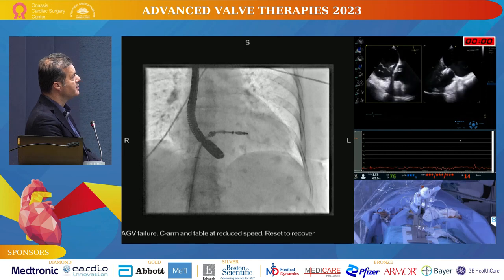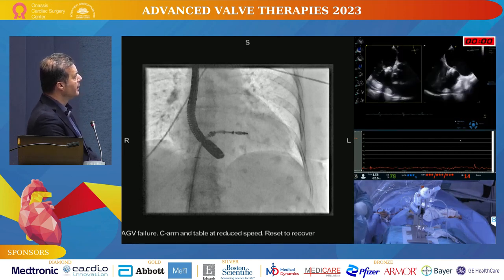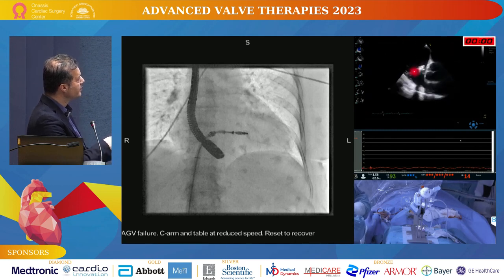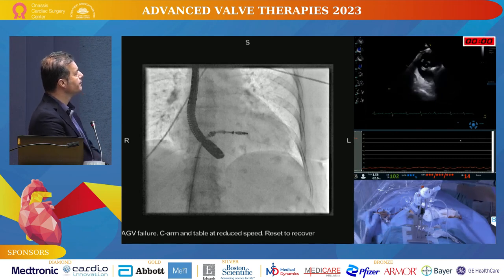You see that the leaflets are coming horizontally into the clip. They're immobilized. And this anterior part of the valve here you can see is already clipped. We will check it in the transgastric view, of course.